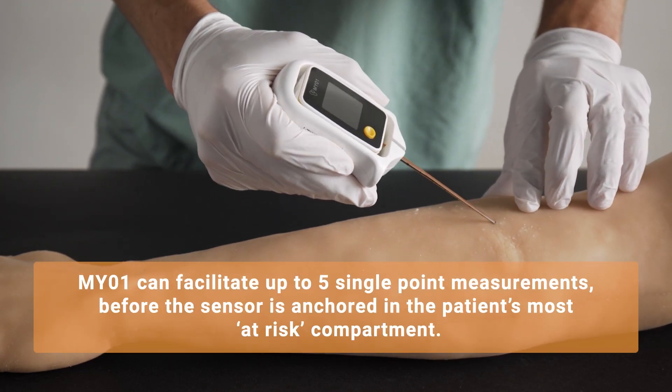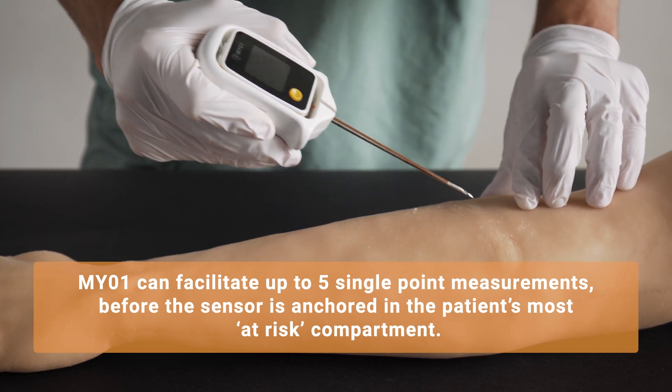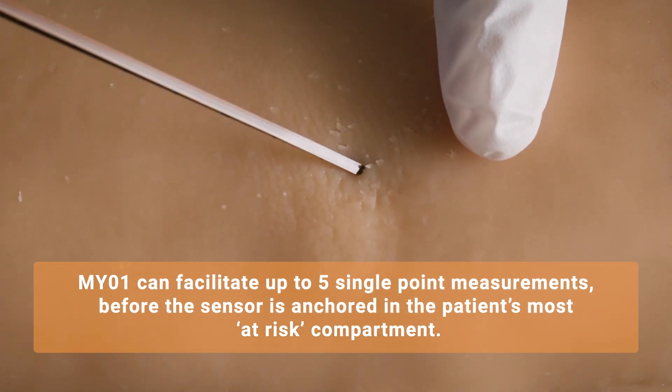Myo-1 can facilitate up to 5 single-point pressure measurements before the sensor is anchored in the patient's most at-risk compartment.